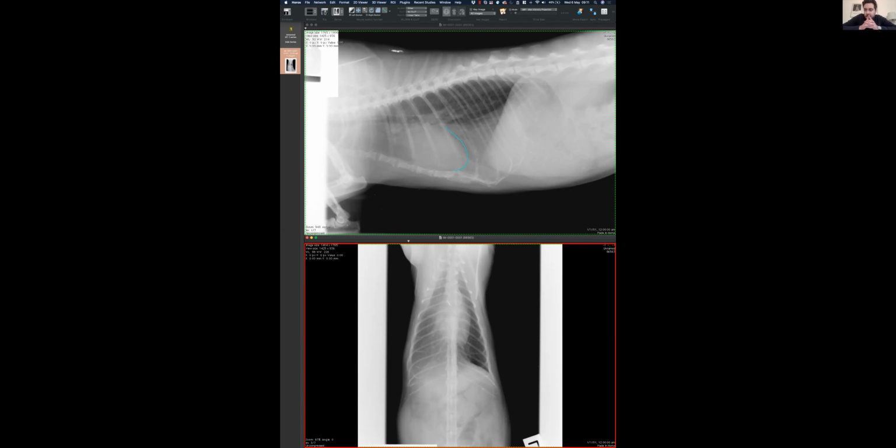Now you're talking about the cranial border. So the cranial border. Okay, good. That's enough. And you feel that that's abnormal, not normal. You just want to mention that you can see the border. That's perfectly fine. So I can see the caudal border, but I can't see the cranial border, and I find that a bit unusual. I've never seen a case like that. That's perfect. Perfect. Yeah.